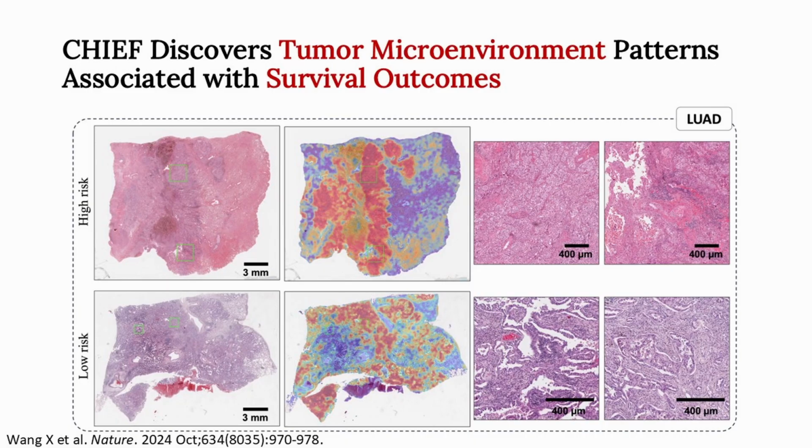types. And in this example, in lung adenocarcinoma, for those with high mortality risk, our model highlighted regions with granular and solid patterns with regions of necrosis, whereas predicting the lower mortality risk cases, our model focuses attention on the regions with papillary architecture and lower grade nuclear features. So this shows that our data-driven approach can help us systematically identify any particular microenvironments related to our outcomes of interest, and this may help us better identify additional previously unreported tissue morphological signatures related to important clinical outcomes.